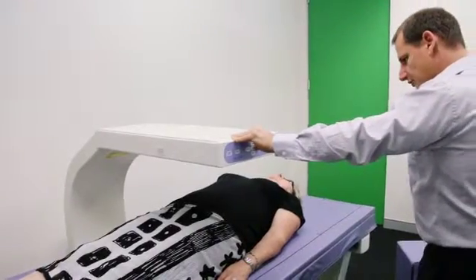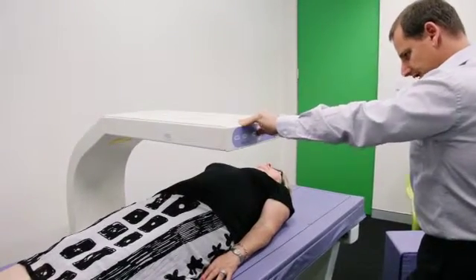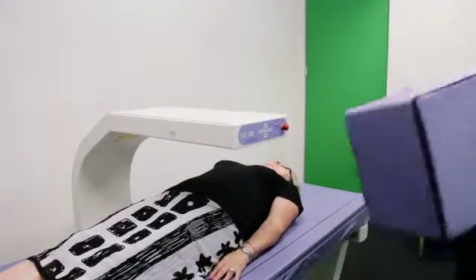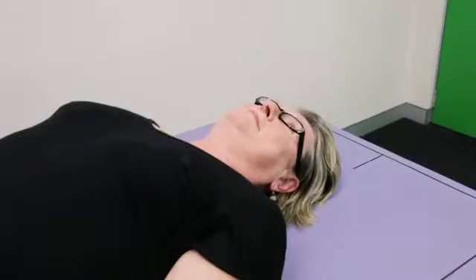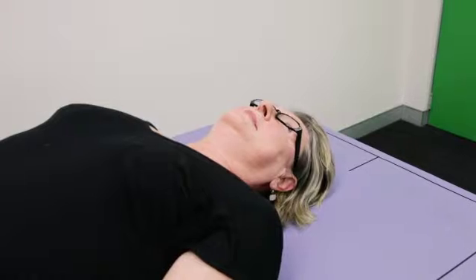Alright, the first scan we're going to do is that of the lumbar spine. So after this arm is placed into position, I'm going to get you to place your legs on top of this box for me. So raise those up for me. That's it. Okay, the scan's going to take 2.5 minutes, so keep nice and still.